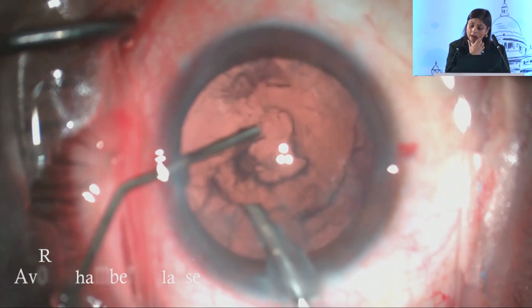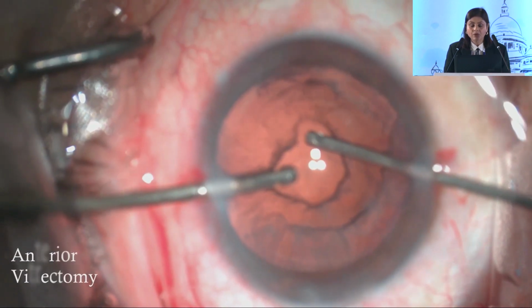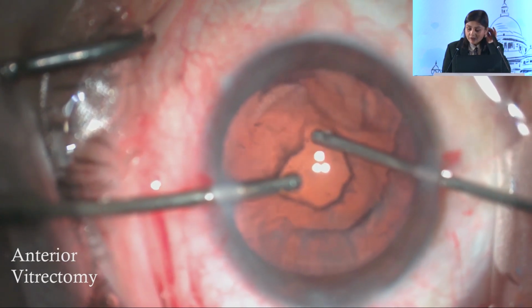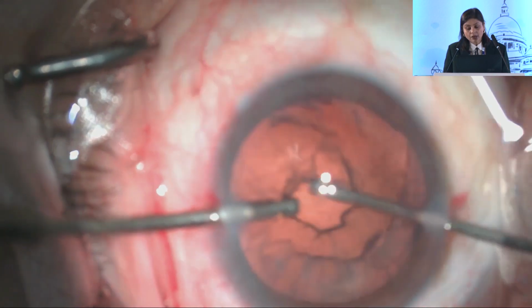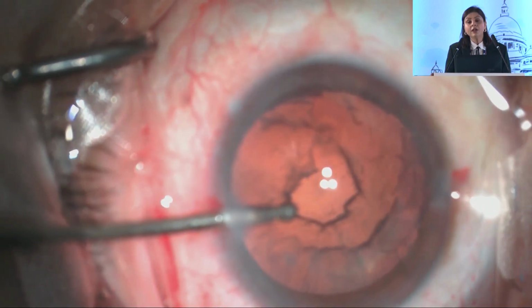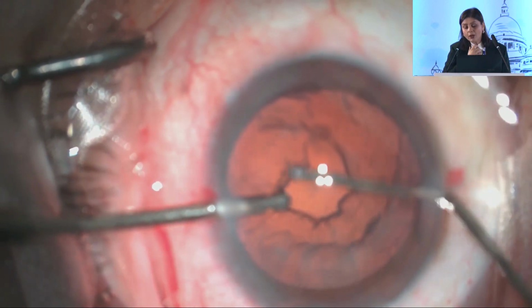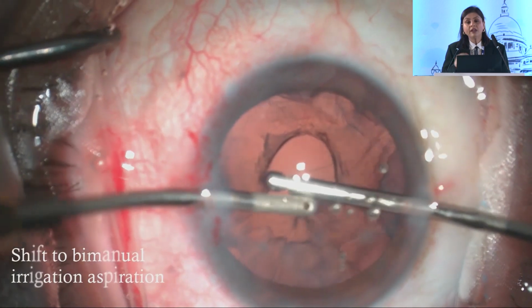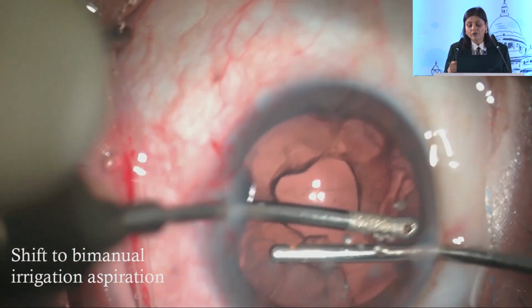Again, inject some dispersive OVD from the side port before we come out in order to avoid prolapse of vitreous into the anterior chamber. Then we are going ahead with anterior vitrectomy to ensure that there is no residual vitreous in the anterior chamber. And now, since we have a significant amount of cortex left, we have switched over to a bimanual irrigation aspiration instead of using the vitrectomy cutter, as it would be very difficult to remove all of this residual cortex with the help of a vitrectomy cutter.